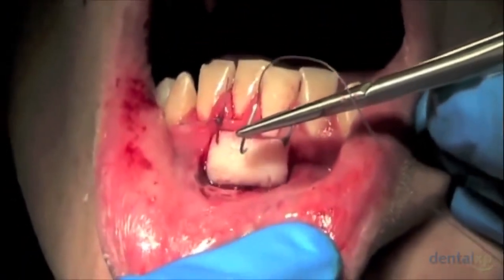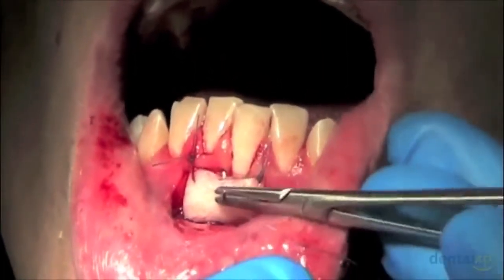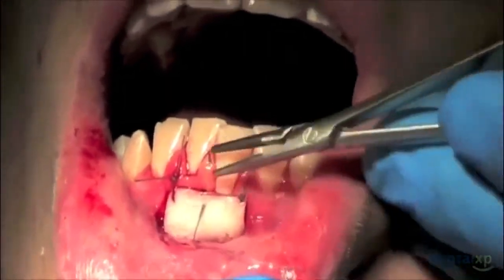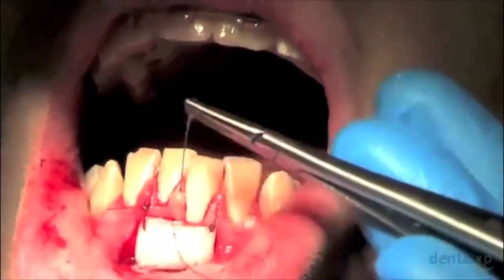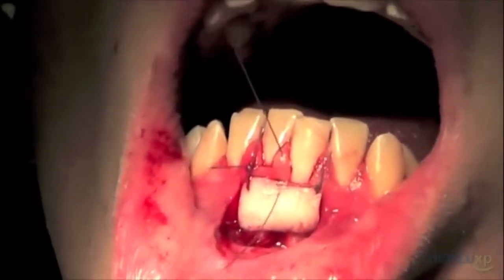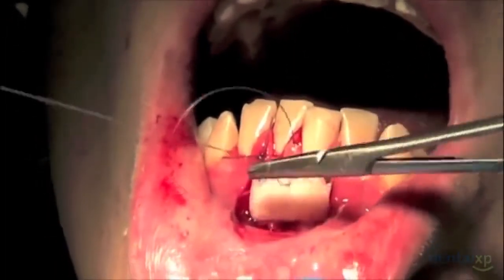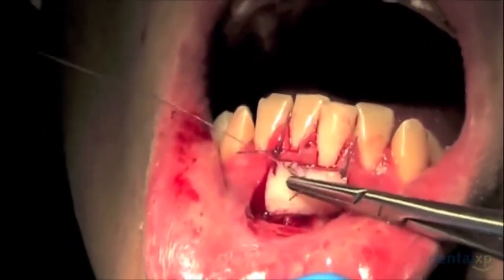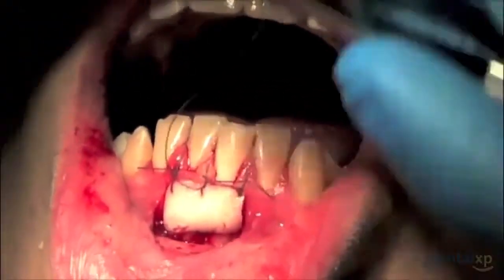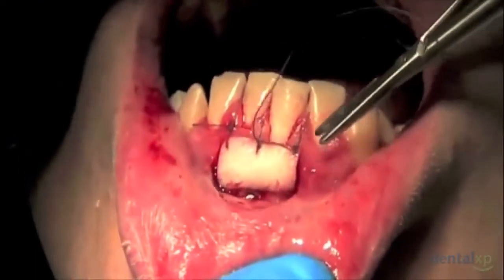And at this point, as we're placing our final suture, you'll notice the lack of significant bleeding there. Hemostasis is relatively easily achieved with just simple moist gauze and pressure. While I'm putting in this final suture, I want to point out that other alternatives to treating this defect today would be something like a connective tissue graft from the palate, or an acellular dermal graft such as alloderm or perioderm or some similar product as well.